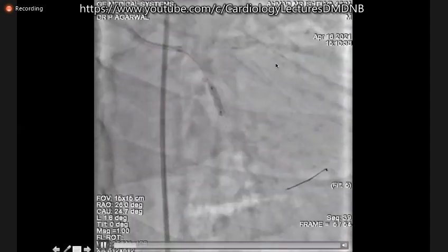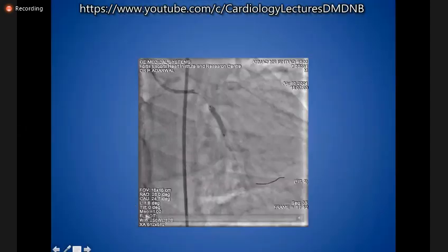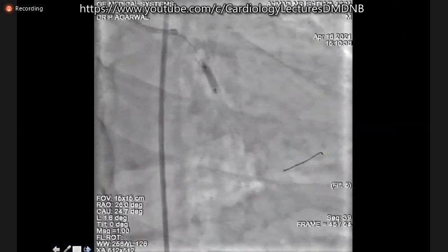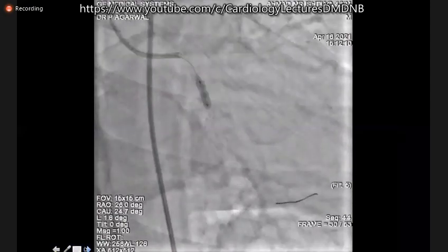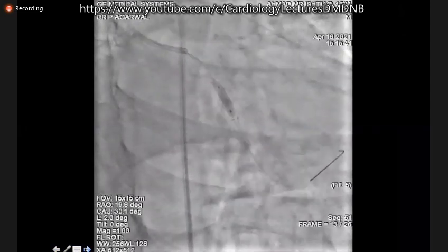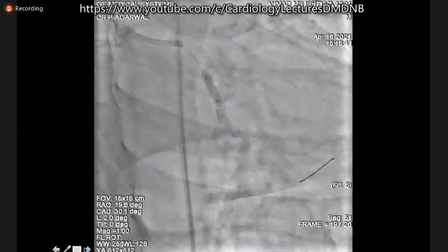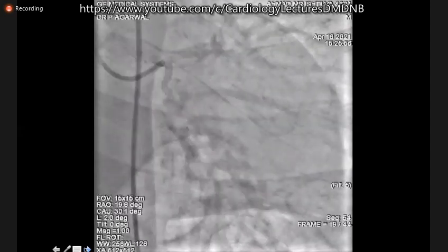And then post-dilating the device with a 3.5 balloon very aggressively, and taking care of the margins also, in the center where the main lesion was. Initially this was a 3.5, then again a 3.75 balloon inside, at really good atmospheres, maybe 25, 27 atmospheres, because I really go very high pressure on these devices whenever I'm taking a scaffold.